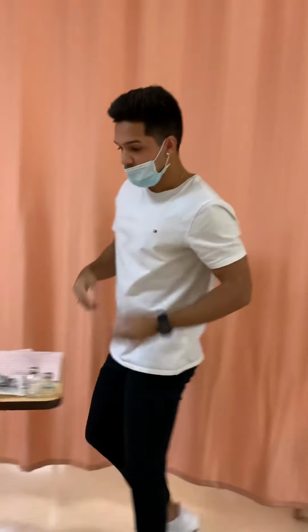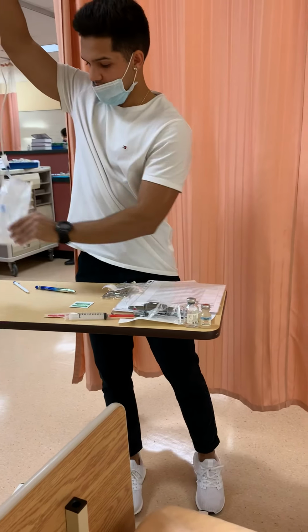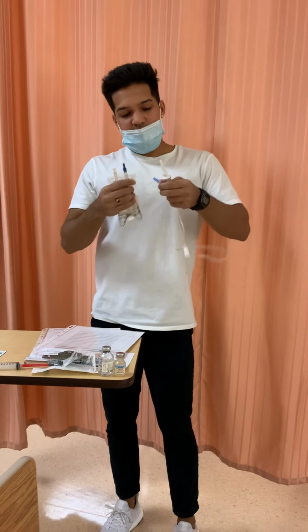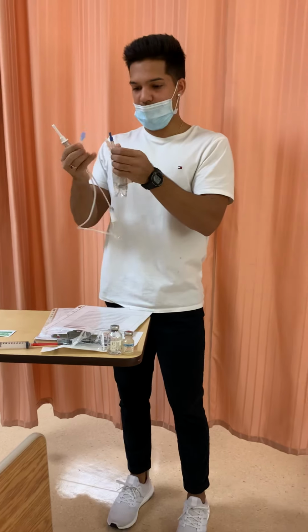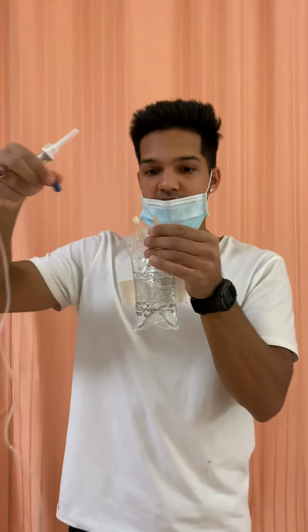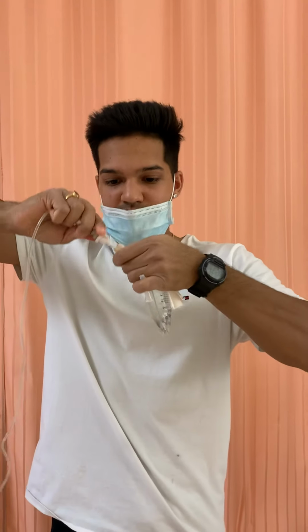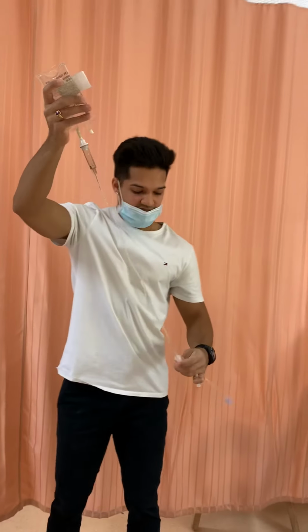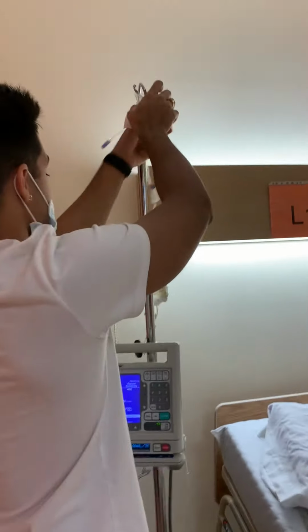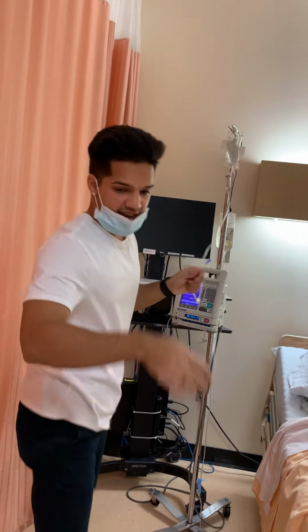Now I'm just going to be taking my secondary tubing, taking it out of the bag. First thing we're doing is just spiking my bag. I'm going to be taking this off and then just dropping it, and then I'm going to be uncapping my spike and then spiking my bag properly. Spike my bag, and then once I've spiked it, I'm just going to put that cap down. I'm just going to be hanging my secondary bag up. And once I've hung up my secondary bag, I'm just going to be taking an alcohol swab.